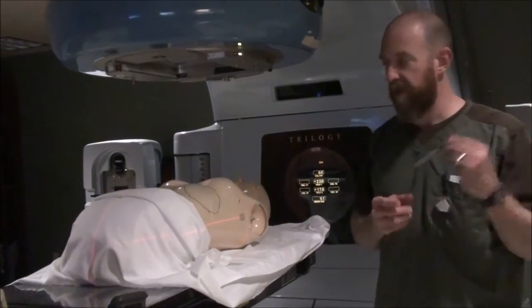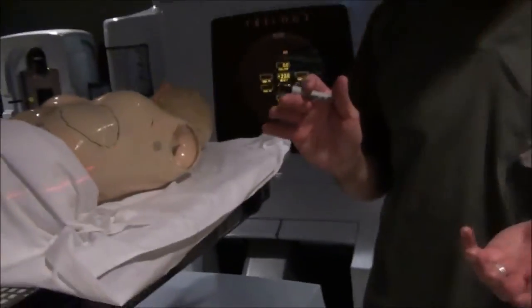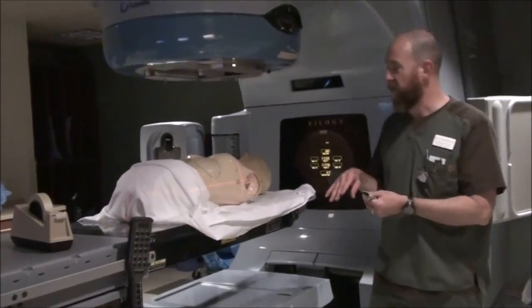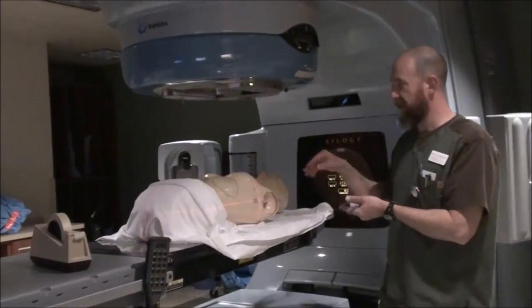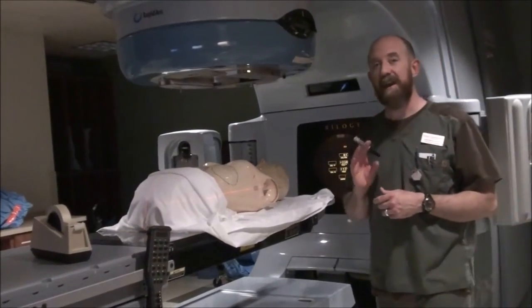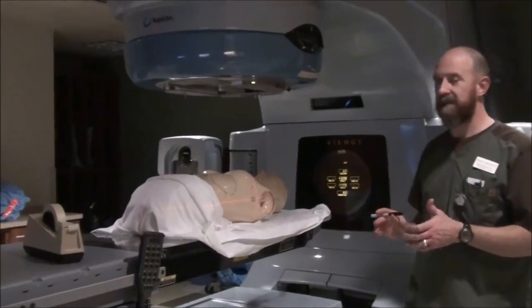When you come into the room, go ahead and mark the CR. Now that you have the CR, this is a case where we want to know what mid-plane is. We're not going to wait until the end to take our calipers and get a separation — since we have everything set, we'll go ahead and get a separation here. Get a mid-plane separation and calculate the SSD. The next thing you want to do is determine your dose points.